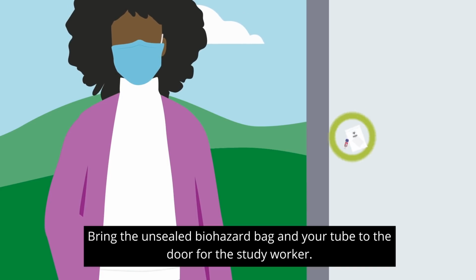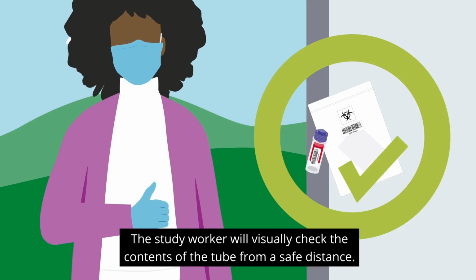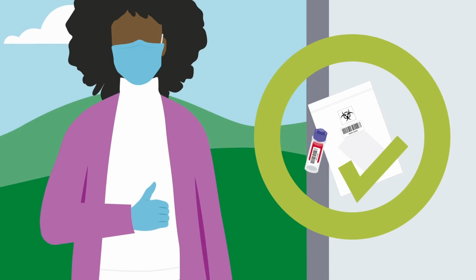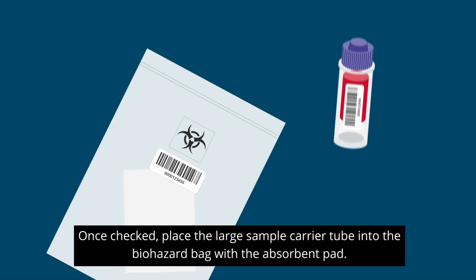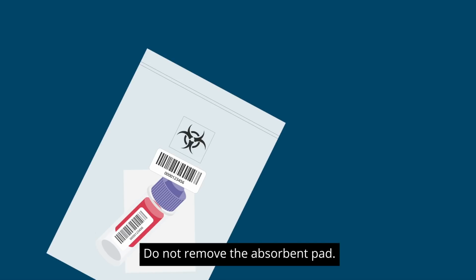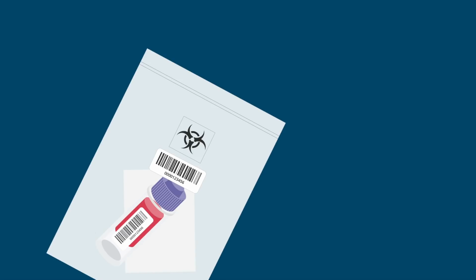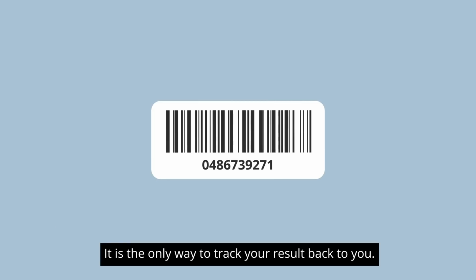Bring the unsealed biohazard bag and your tube to the door for the study worker. The study worker will visually check the contents of the tube from a safe distance. Once checked, place the large sample carrier tube into the biohazard bag with the absorbent pad. Do not remove the absorbent pad. The barcodes found in your sample pack are unique to you, so it's vital that you don't get them mixed up with anybody else's. It's the only way to track your result back to you.